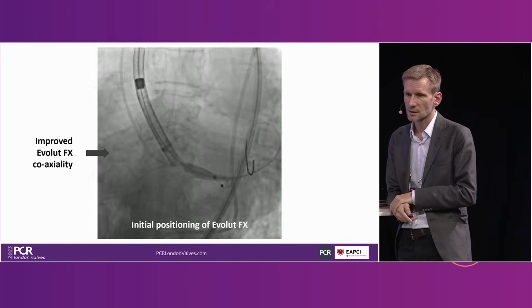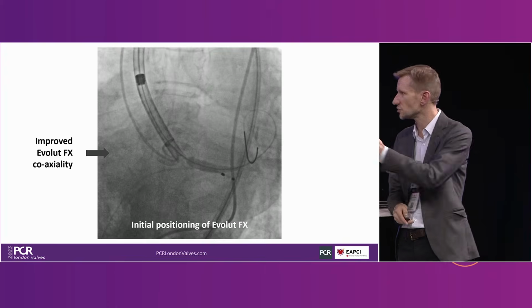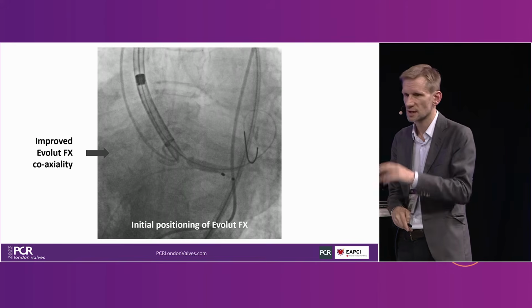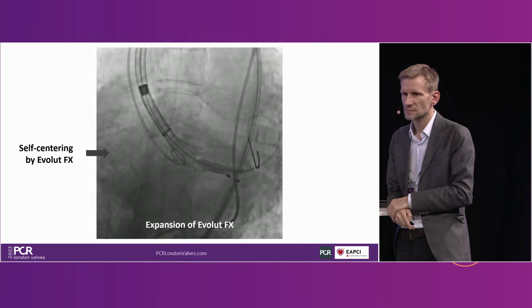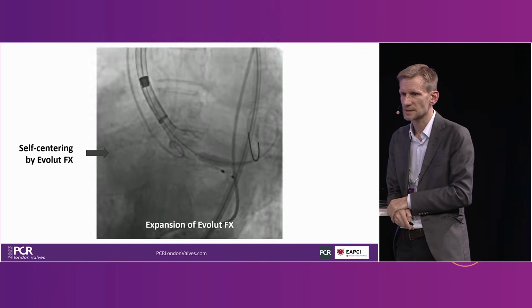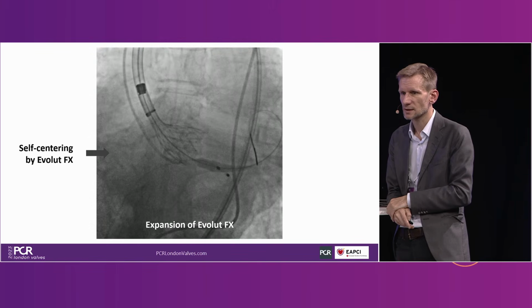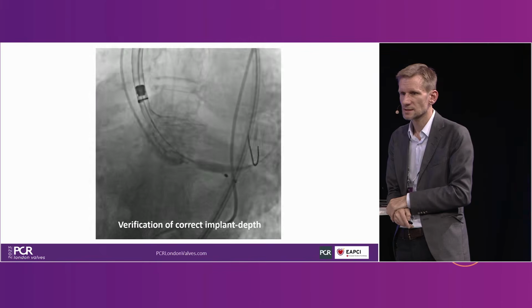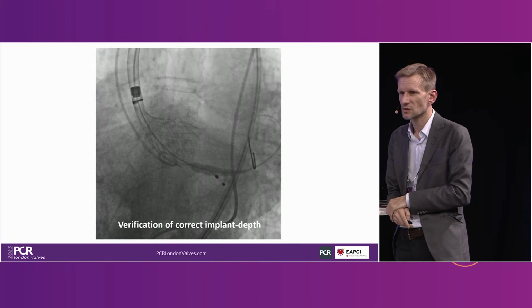And then we position, this is cusp overlap. We start there, as you said, Stan, also just at your 0 level. We don't start mid-pigtail. We give some pacing. We expand them. This is typically a pacing of around 120, 130, max 140, I think. And then this is the expansion. There's quite some leak to see here, but that doesn't always say a lot.